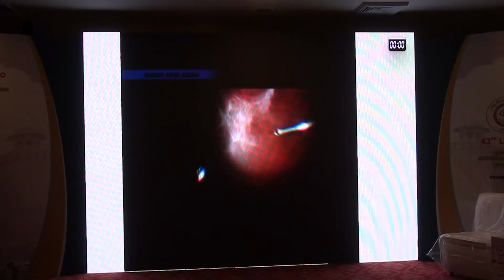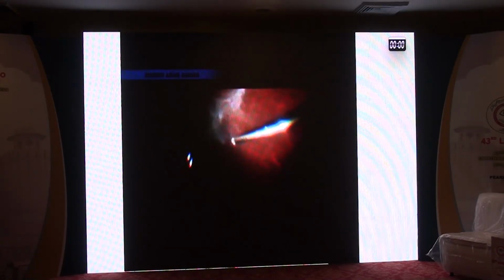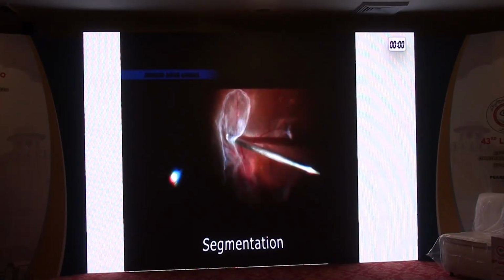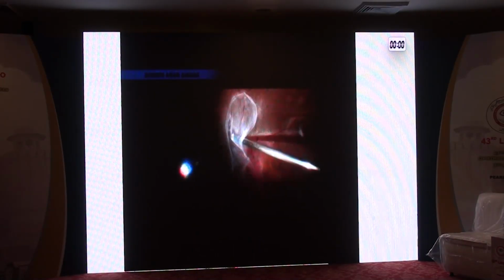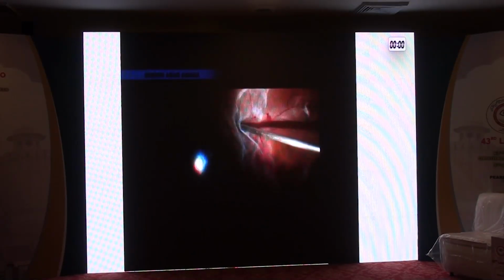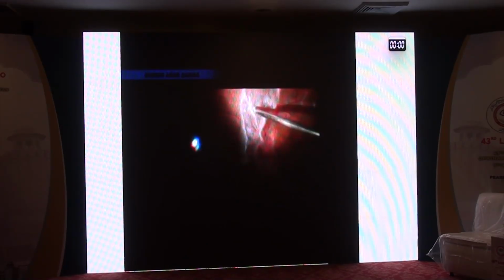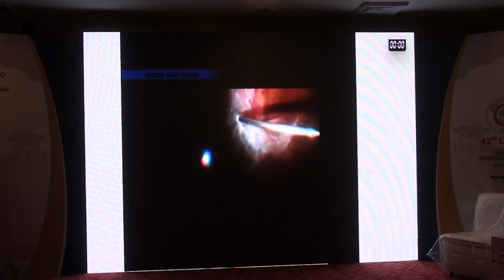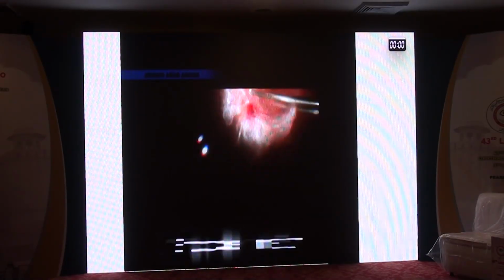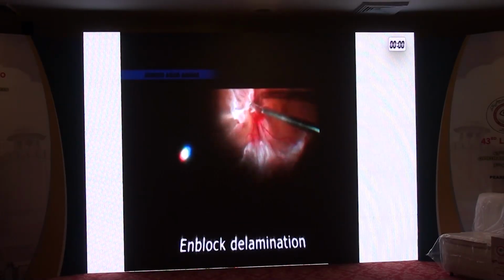Next, we are going to do segmentation of the individual membranes, the FVPs. We are going to find some space between the FVP and the retina, and then cut it free from the retina. Next, I am going to use the forceps and do some en bloc delamination.